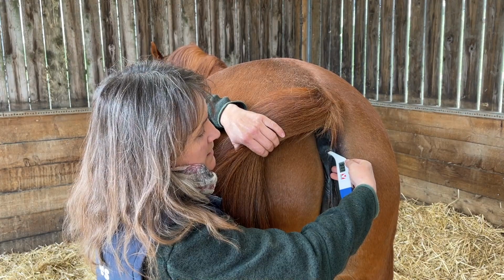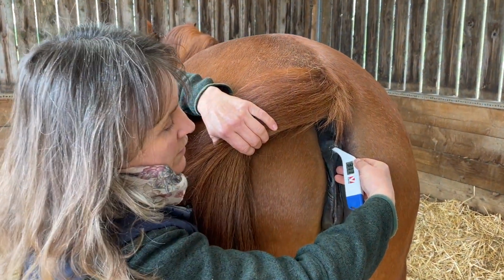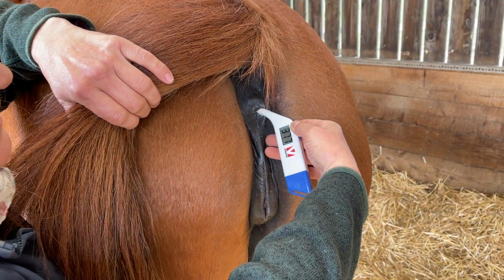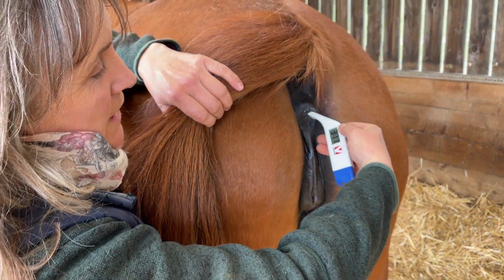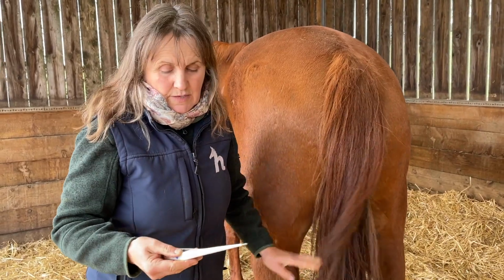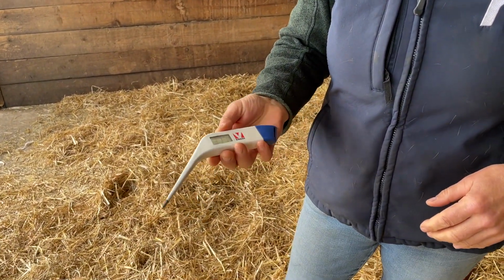It's reading 37.7. I don't know whether you can see that on the camera, but I would say the time that it's taken now, we're going to have as accurate a reading as we're going to get. And so I will gently withdraw, and we'll clean this later, but we'll just get rid of the Vaseline on her tail. So she's reading at 37.7 degrees.